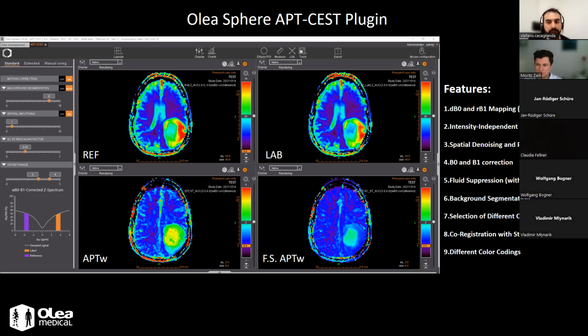Then we perform the B0 correction. This is the B0 correction that is known in the community: we interpolate the spectra and shift it to 0 ppm. This can be performed with the B0 map from WASABI, or the B0 map coded by Patrick. If there is no B0 map available, we compute it with the minimum of the smoothing spline of the data spectra. And so we are able to get a good B0 approximation.